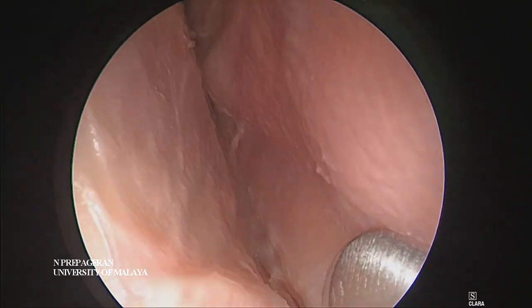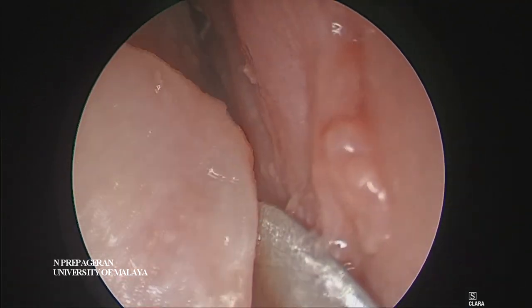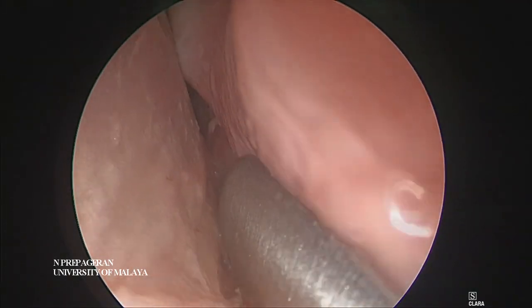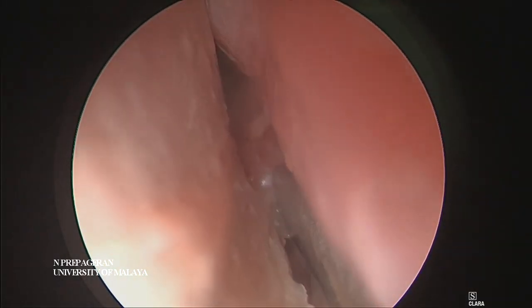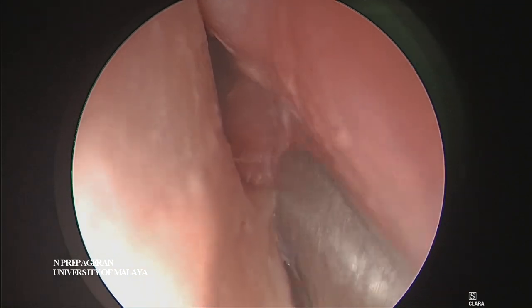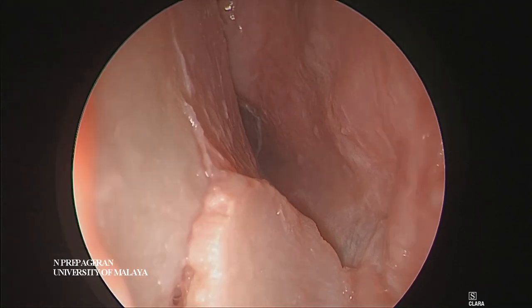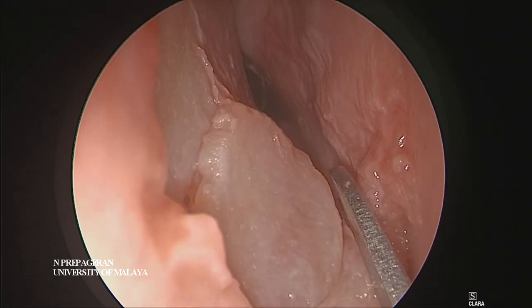There's a small tear here where the spur was. If you want a big flap you can actually go all the way down along the floor if required, but here it's not so easy because of the spur. I'm going to cut this along the floor, just above the floor, for the septal flap.